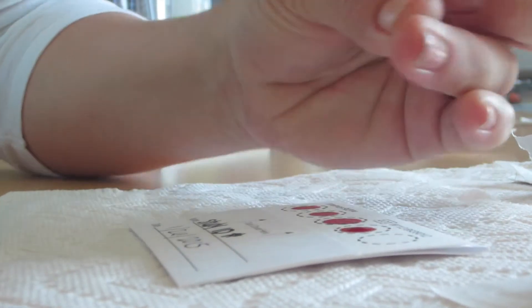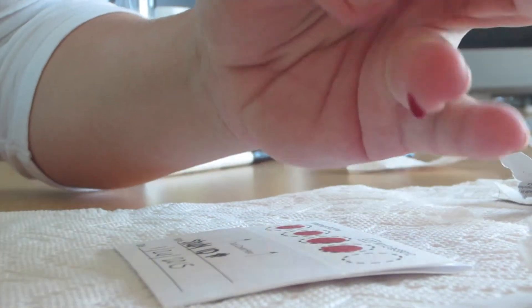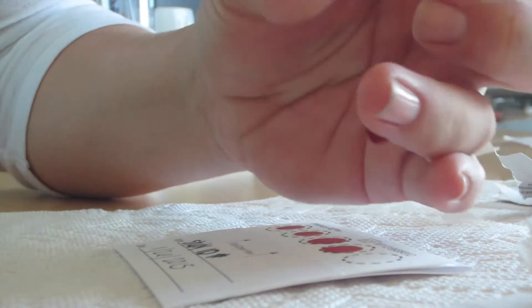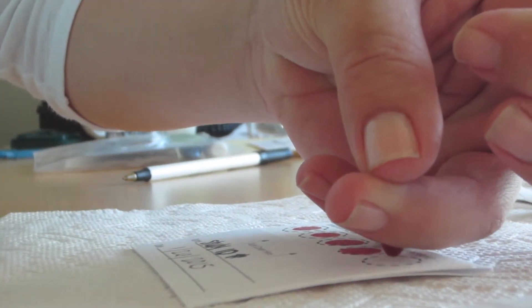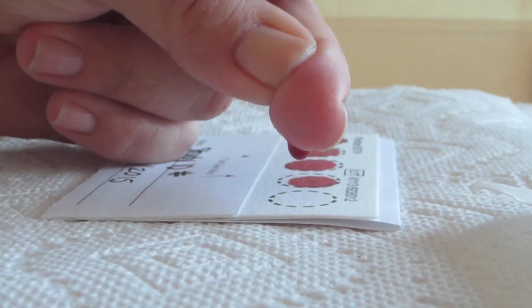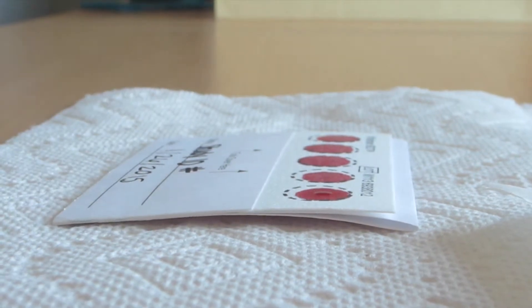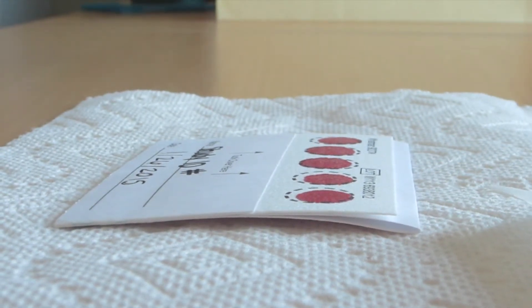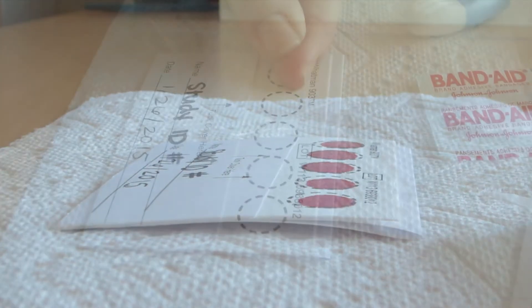Continue milking the finger and hold the drop of blood over one of the circles on the collection card. Let the blood drop fall onto the middle of the circle. Place one large drop of blood that falls per circle and fill the entire circle. Follow the above procedure for all five circles on the collection card.